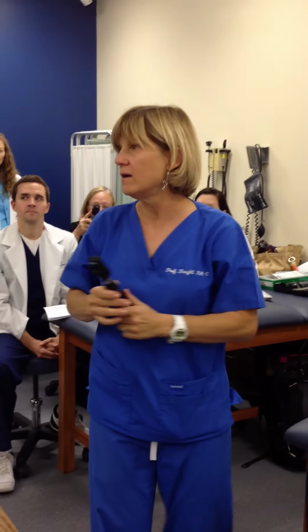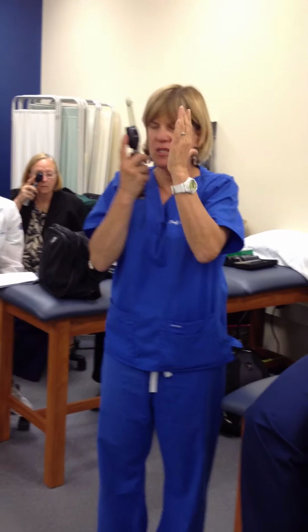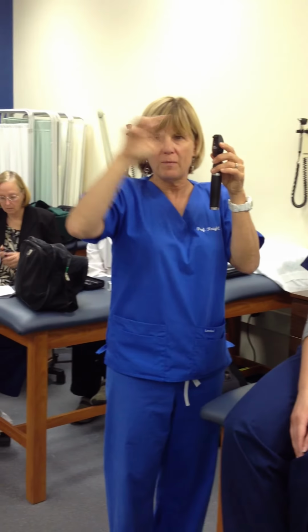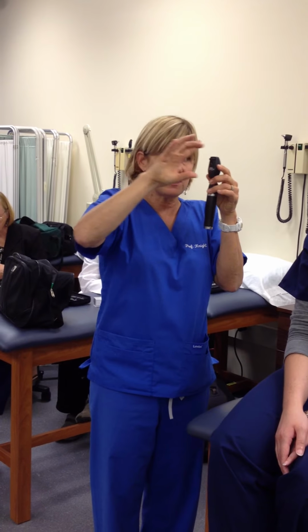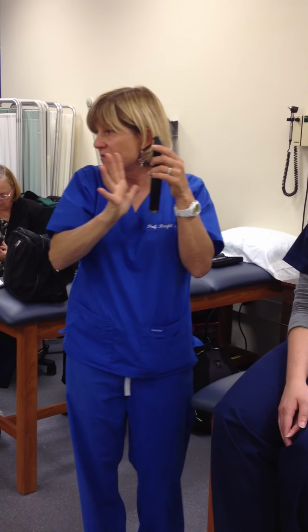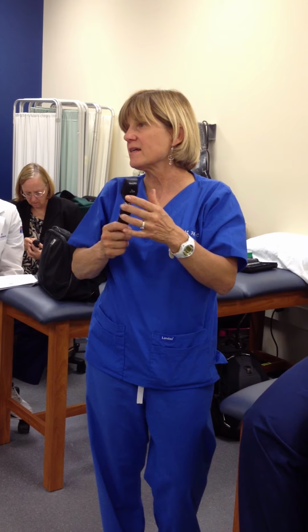Did you change your focus off of 0? I kept my focus on 0 there, but I will tell you, and practice this, you guys, when I come in and spot a vessel, as soon as I spot that and get in position, I can take my focus and get it on the more positive and get it out a little bit so we can see the more anterior structures, and then focus it down to see the back of the eye. They do our fundoscopic exam then on the eye, and see the retina and everything. So you can play with that and work on that while you're practicing for now.